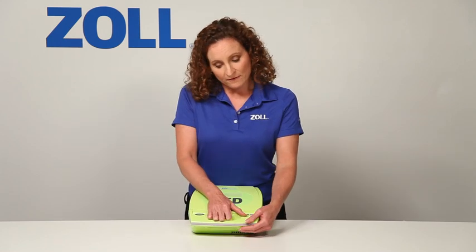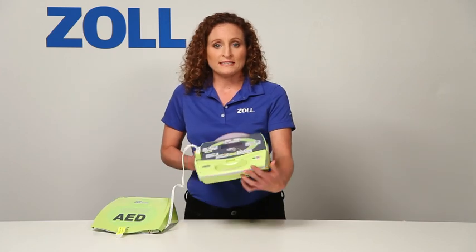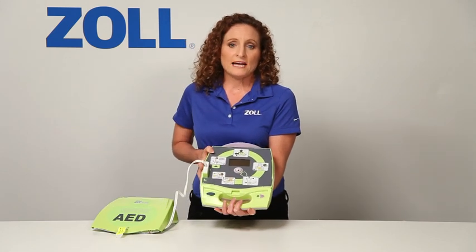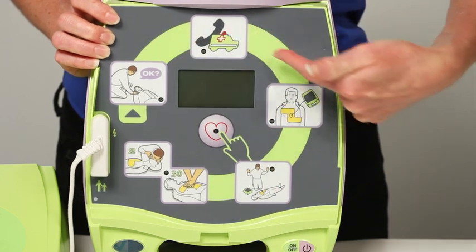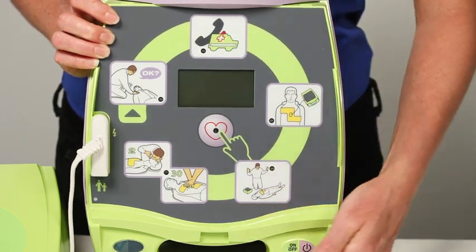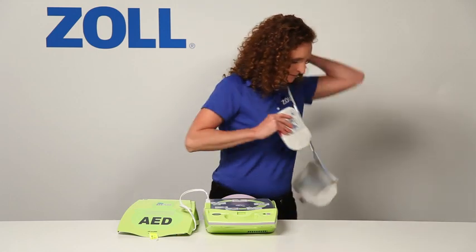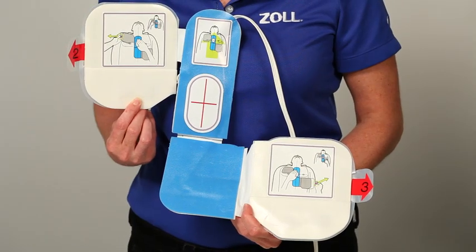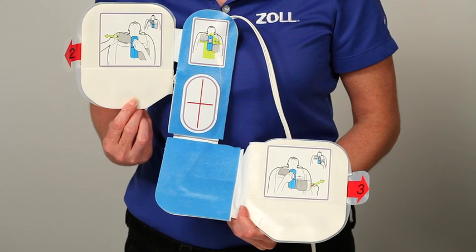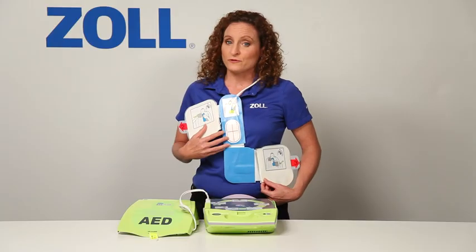Here we have several graphical icons. When I turn on the AED Plus, it will provide an audio prompt and light the icon for each of these rescue steps. These are CPR-D pads, which are quite different from the two electrode pads found on other AEDs. They are designed for fast, accurate electrode placement.